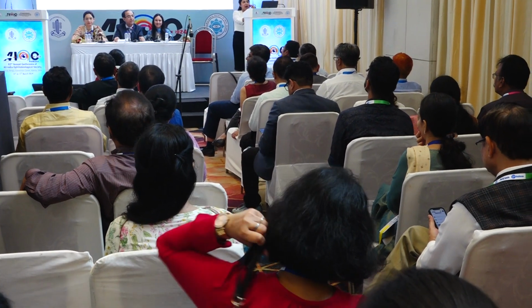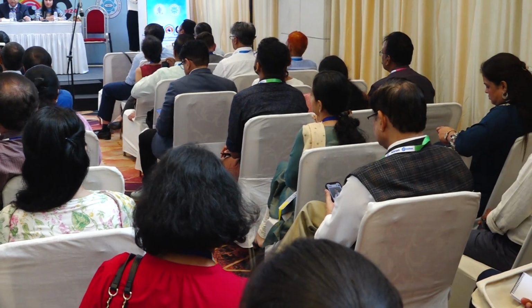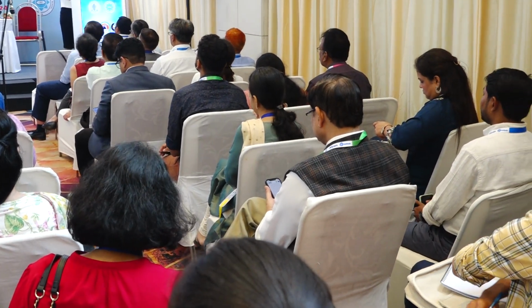Good afternoon, everyone. Thank you for joining us, and thank you for the opportunity. So I will be talking about the power modulation in phacoemulsification. As we know, the phaco machine has a lot of functions, and the interrelationships are called phacodynamics. There are two main functions. One is the ultrasonic power, which I'm going to talk about today, and the other is irrigation aspiration, which is the safe suction of the emulsified material.